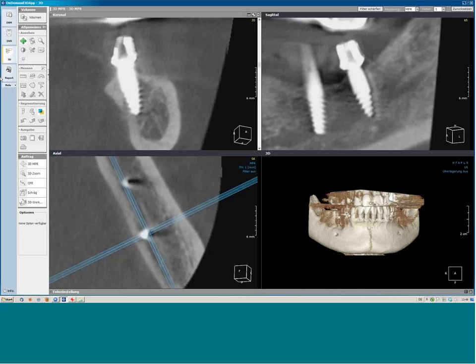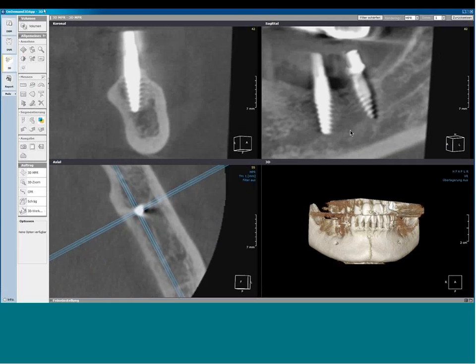The patient told me that once the implants were inserted, she never felt anything on this side, which is really clear when you see that the complete lumen of the mandibular canal is obstructed by both implants, and that means that all the neural sensations are blocked here, and there's no further information delivered to the brain. So very clear. You all know these kinds of figures.